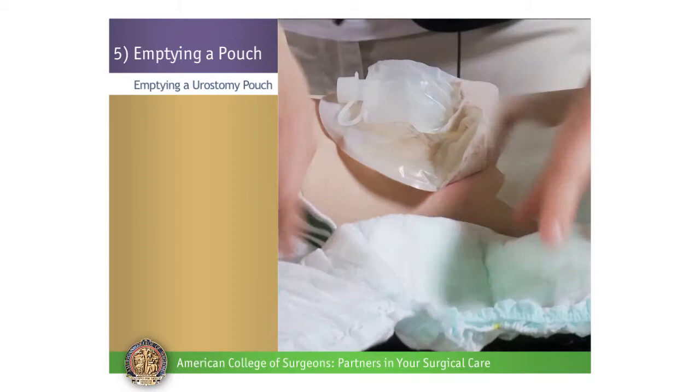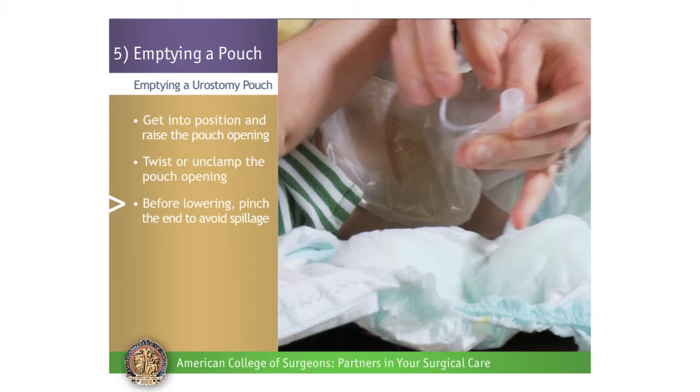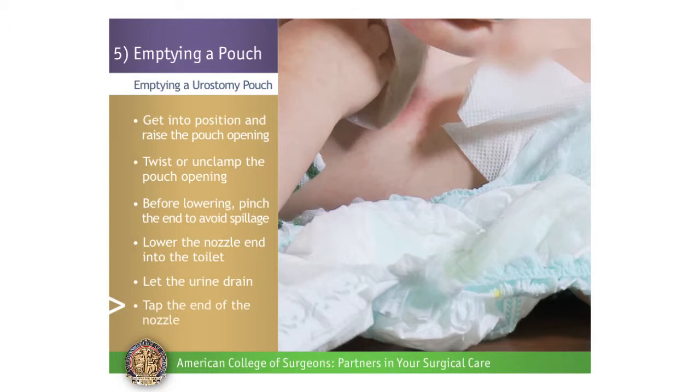To empty urine from the pouch, get into position and raise the pouch opening. Then twist or unclamp the valve to open the tap or nozzle. Before lowering it, pinch the end to avoid spillage. Lower the nozzle, release your pinched fingers, and let the urine drain. When the pouch is empty, tap the end to remove any remaining drops of urine. Then close the pouch by either twisting the nozzle, replacing a nozzle plug, or folding up the nozzle.